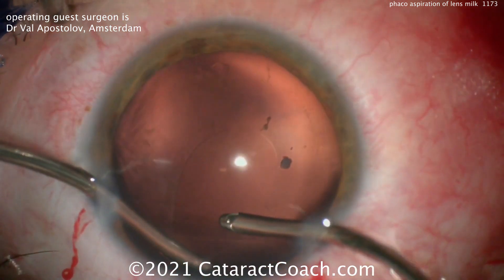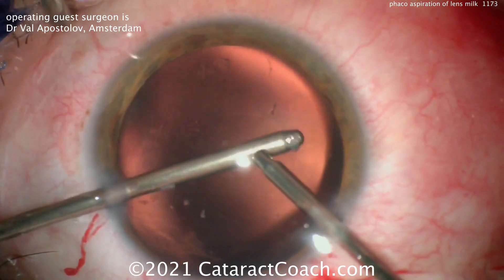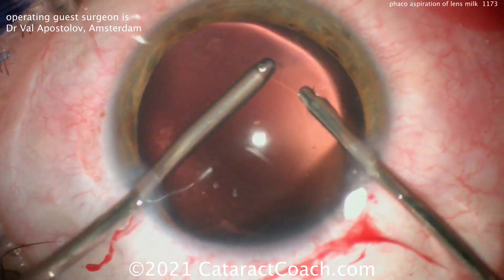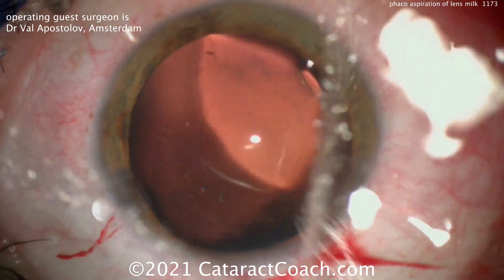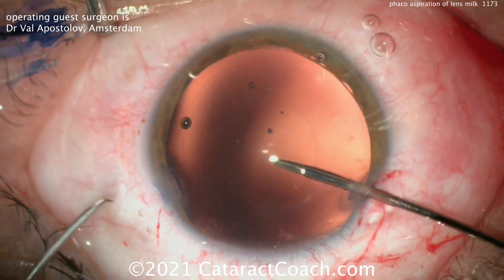With intumescent white cataracts, remember these are the ones that carry the risk of the Argentinian flag sign — where you have an uncontrolled rip of the anterior capsule rim, with a white center flanked by two sides that are blue, resembling the Argentinian flag.